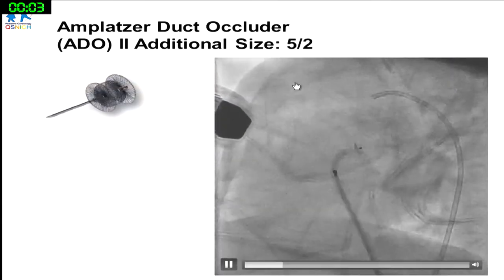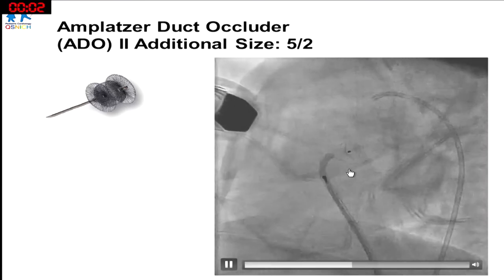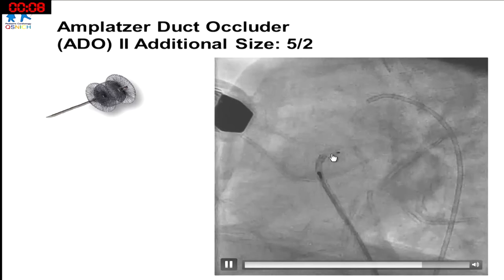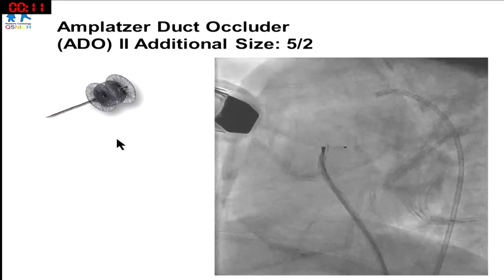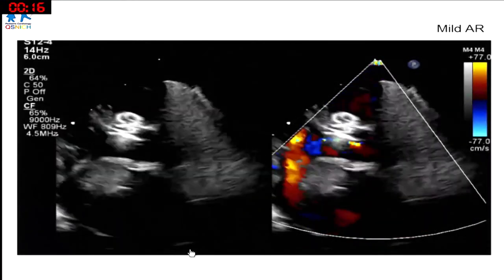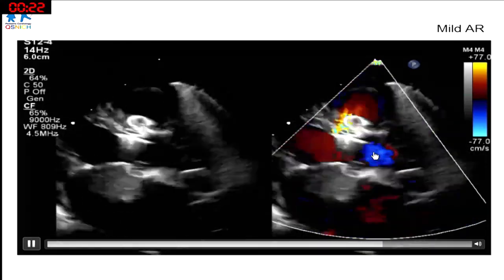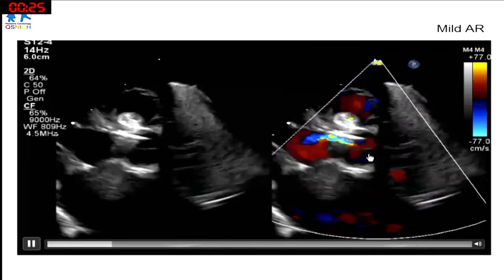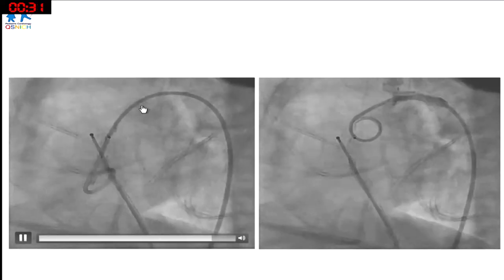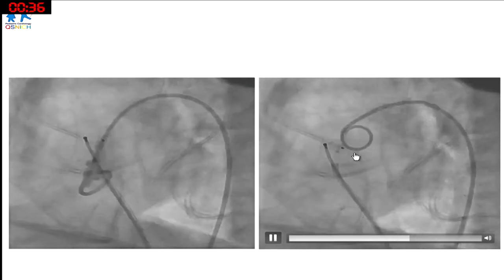This is the ADO2-AS 5.2: the 5 means the diameter is 5mm, and the 2 means the length between the discs is 2mm. We deployed it in the conventional way from the left ventricular side and opened the discs. On echo, it was still touching the aortic valve with mild AR — there had been no AR previously. On LV angiogram it looked okay, but aortic root angiogram showed trivial AR.